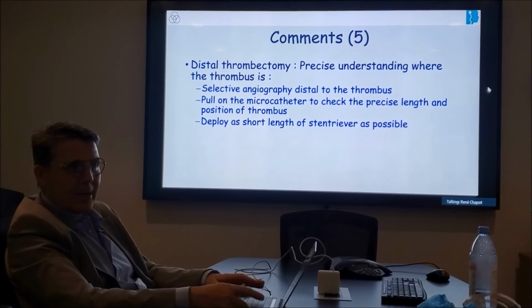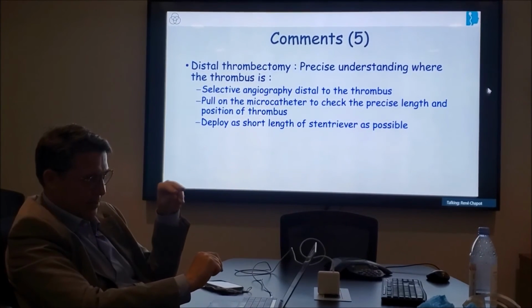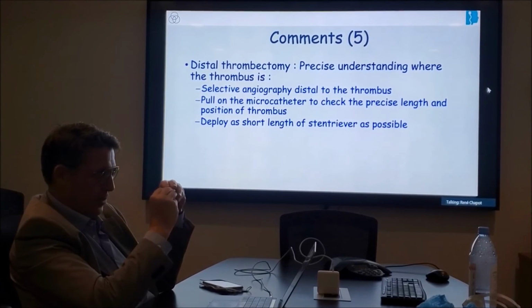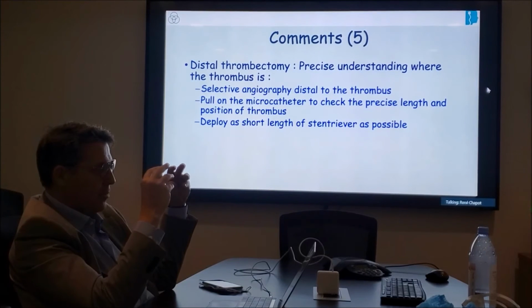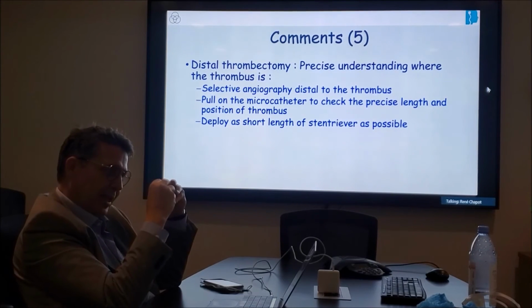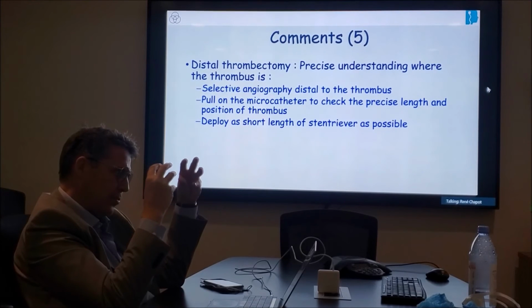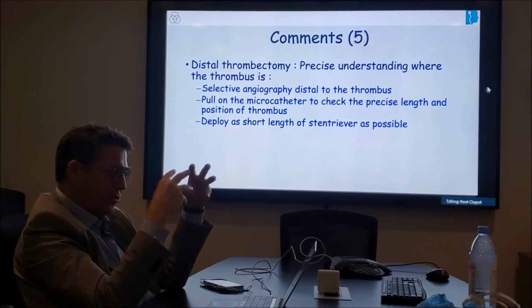We're pushing. So the counterpart is what Ahmed says, that you're pushing on the device, because if you deliver it, you've got some level of opening. But just like a stent or flow diverter, if you want it to be well open, you push on it, it increases the radial force, increases its ability to expand, point 1, and point 2, then we pinch the clot.